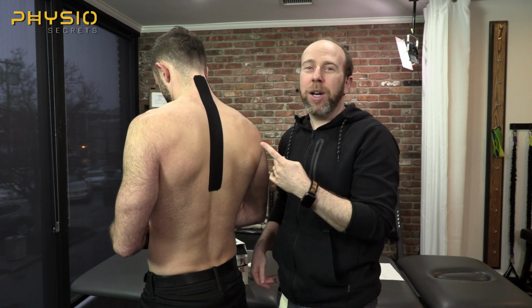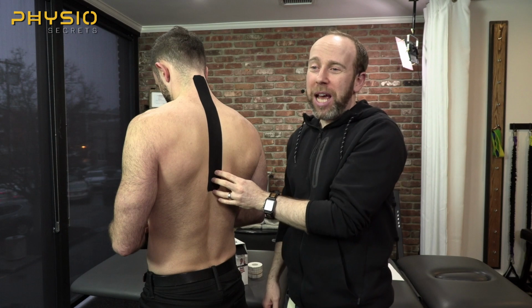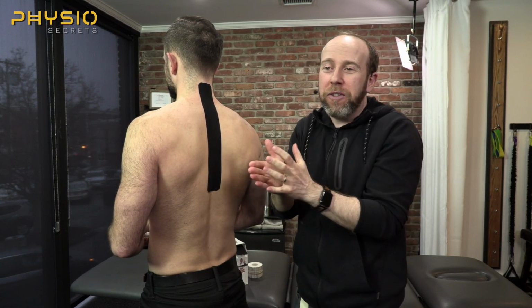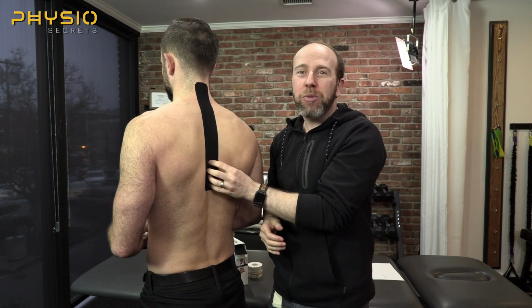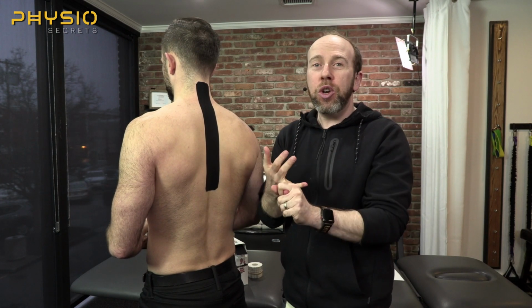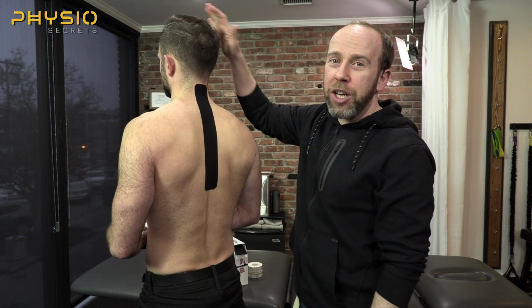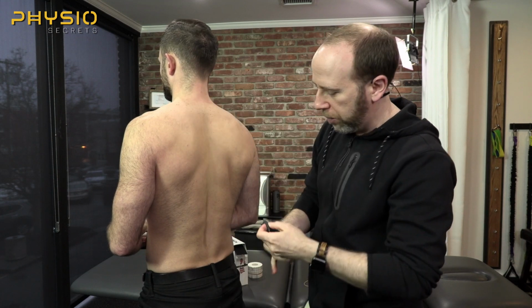With K-tape, because it's flexible, guess what happens to the tape? It stretches. So once this tape starts to stretch out, he's going to feel the tape less. In addition, because he feels the tape all the time anyway, there's no on-off, like I feel it, I don't feel it. So he's going to start to ignore the tape. So while this is a decent anti-flexion tape job, it's not the one that I prefer. One, because they start to ignore the tape job, and two, because as he looks through the tape, it's going to start to stretch, and then he will stop feeling the tape as a whole. Okay, so decent application, but not preferable. Neurological intention here.